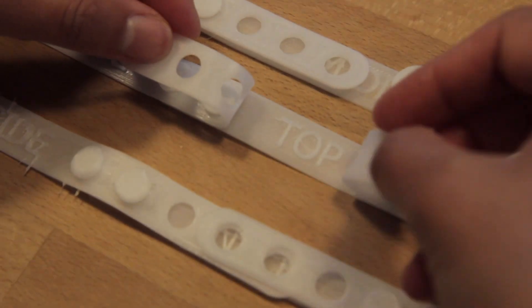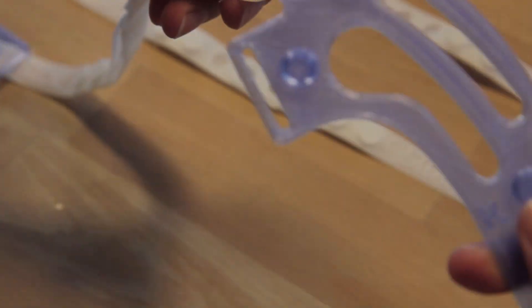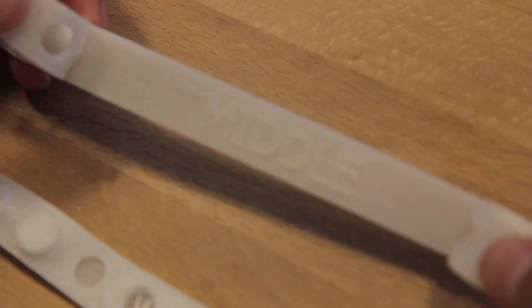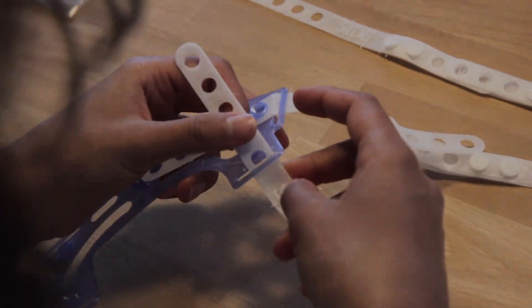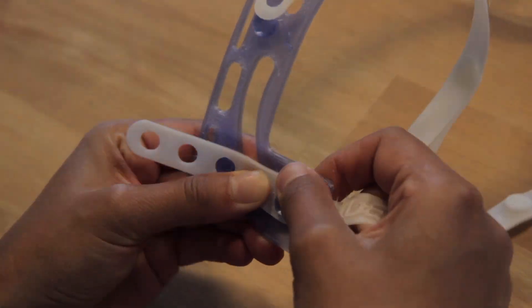Connect the top strap to the upper part of the head mount and do the same on the other head mount as well. Repeat this procedure with the middle strap on both sides and also with the neck straps at the bottom of the head mount.